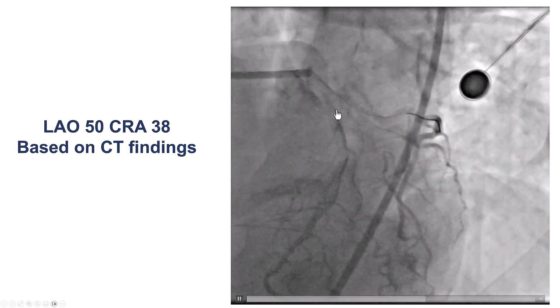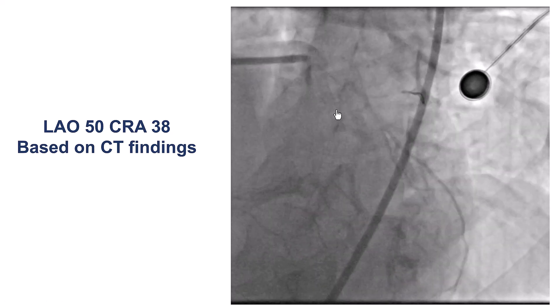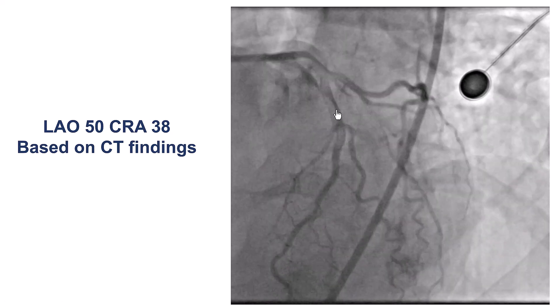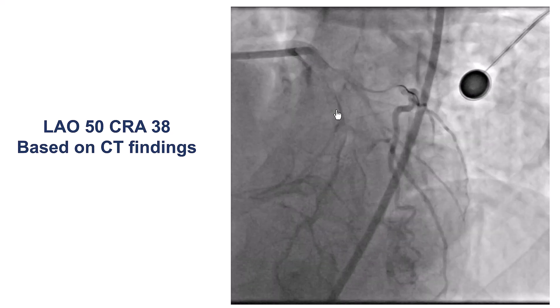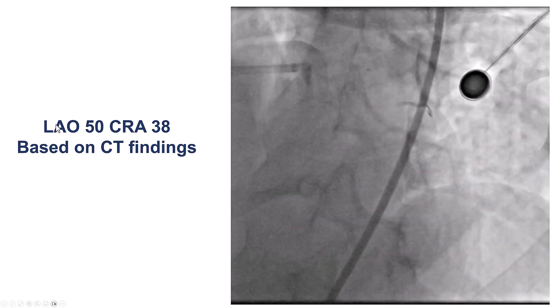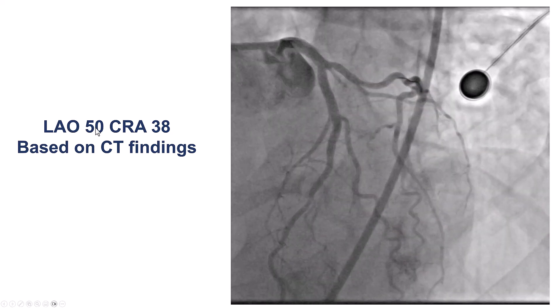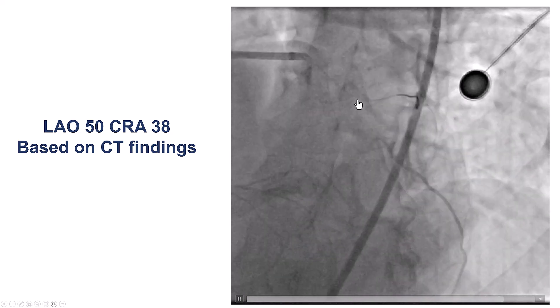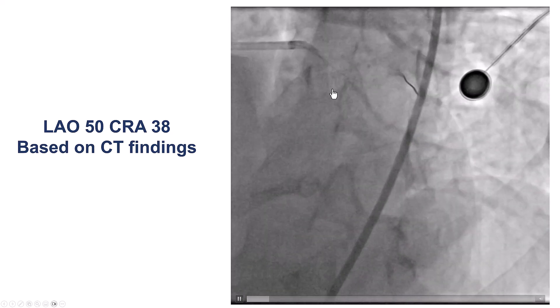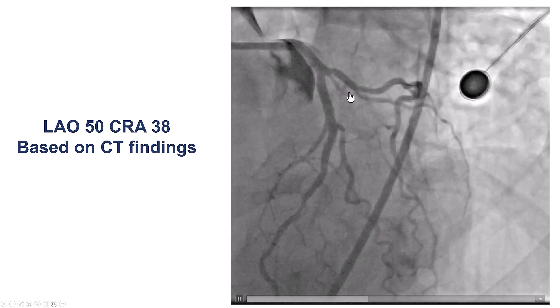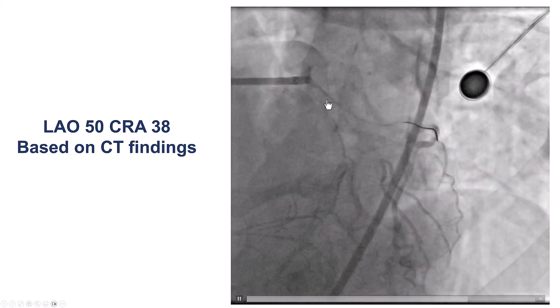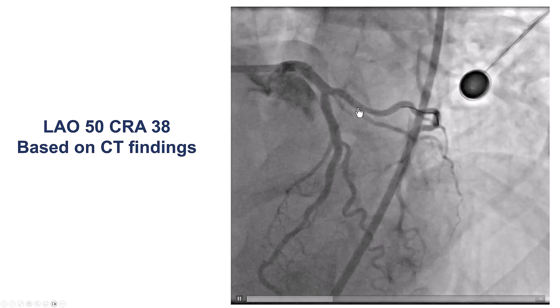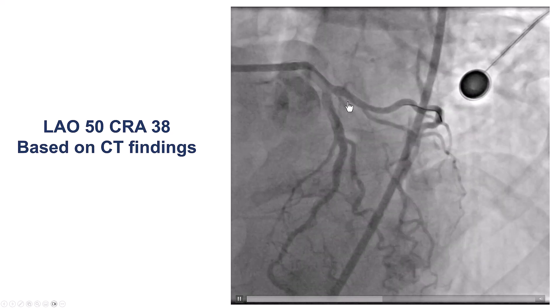Another benefit of using a coronary CT is that we could determine the optimal view for visualizing the occlusion. It was actually a very steep LAO — 50 LAO, 38 cranial — and by doing this, we can now see much better a separation between the LAD, circumflex, and the Ramos branch, and we can see the proximal cap a little bit better.